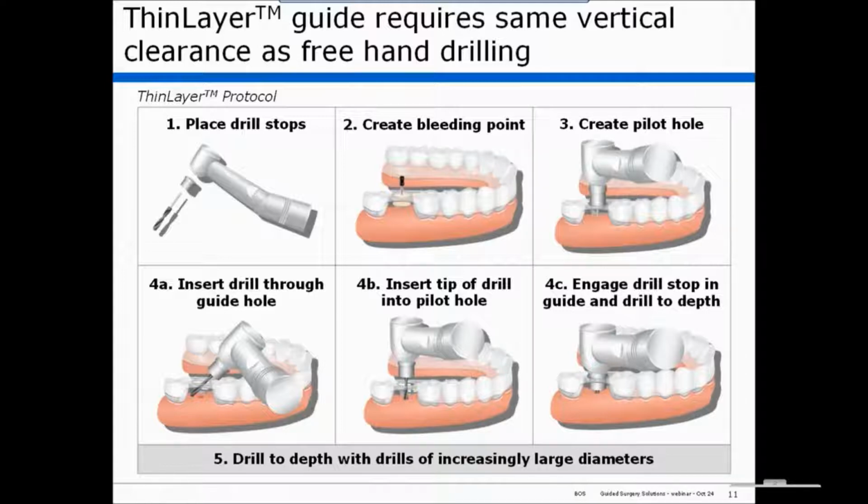So you drag the tip of the drill along the gingiva, insert it into the pilot hole, and drill to depth, as seen in the lower right panel. This procedure would then be repeated with drills of increasingly large diameters.